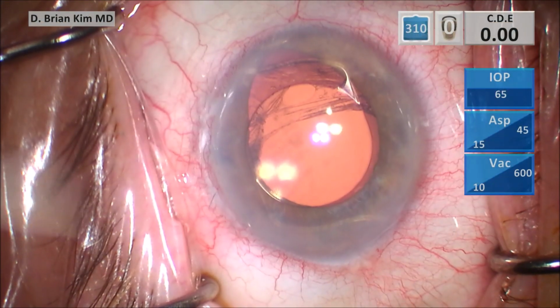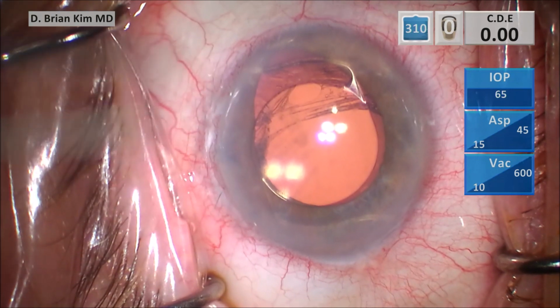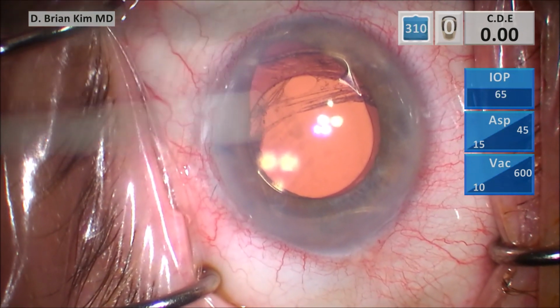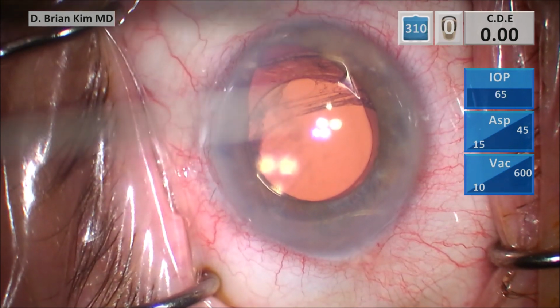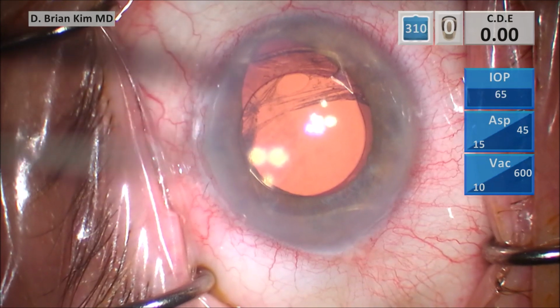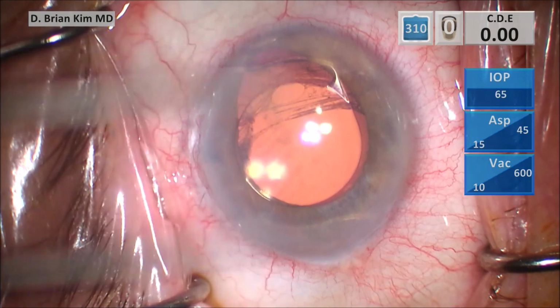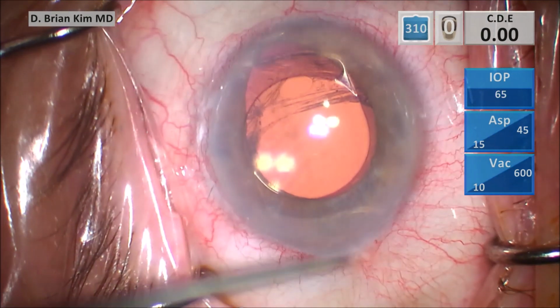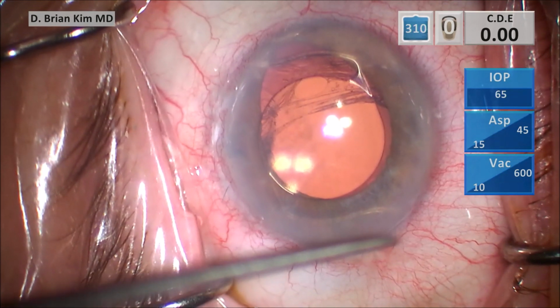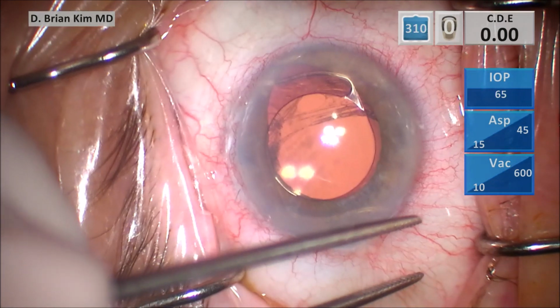And so you can see here, this is the case. You can see the pupil is distorted away from me here, and you can see the anterior chamber lens. Of course, it's really difficult to tell if the anterior chamber lens is in a good place or not, but I suspected it was not. Through gonioscopy, you could see that the footplates of the haptics of the implant were in the peripheral iris and they were not seated in the angle. And so I suspected that was the cause of the persistent and recurrent CME and the patient's persistent visual distortion.